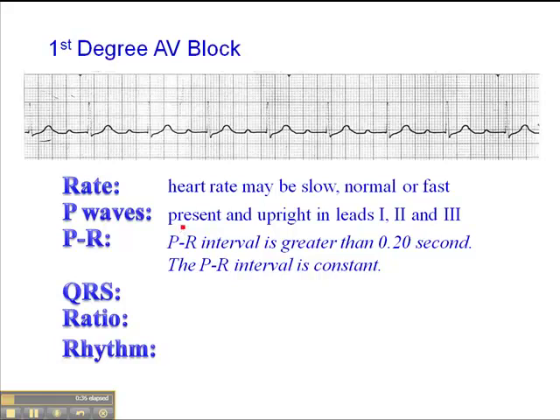Looking at this particular rhythm, the beginning of the P wave falls right on a dark line. We have 0.20 second here, and the QRS begins about there. So this PR interval is actually about 0.20, 0.24, 0.28 — almost 0.32 second. That's quite prolonged. You'll notice that the PR interval is consistently prolonged throughout — it doesn't change throughout the entire process. That's a first degree AV block.